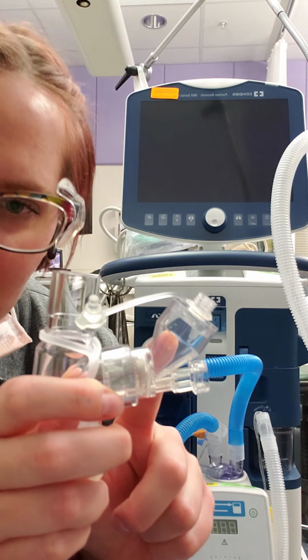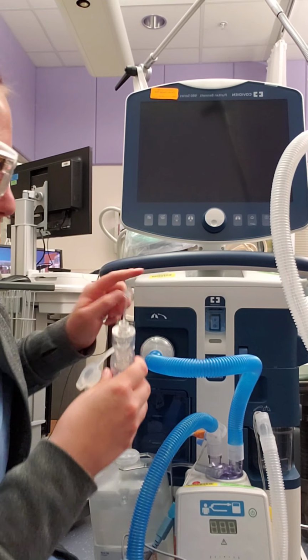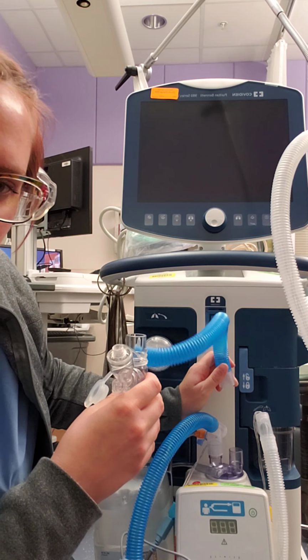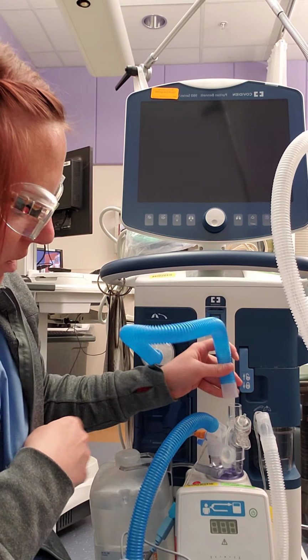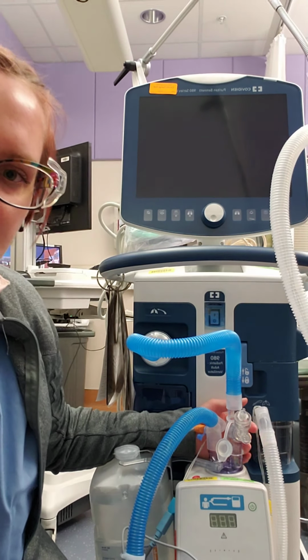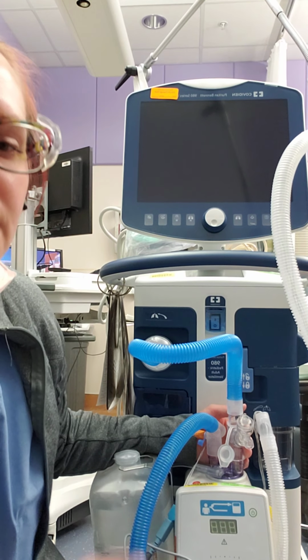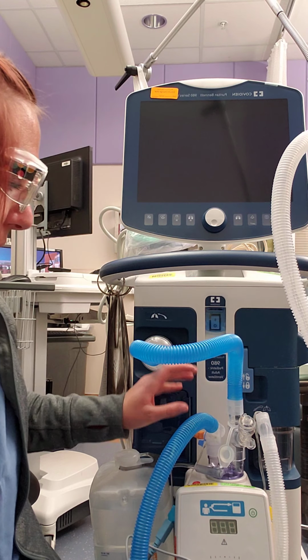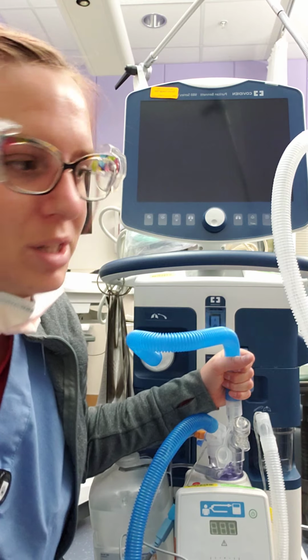Always do your cup up, otherwise your medication will fall down. You will put it on the dry side of your ventilator heater. It should fit right in and then right on top here. So ideally best practice is to humidify aerosolized medications before it comes to your patient. I have seen some RTs try to put nebulizers over here for patients.